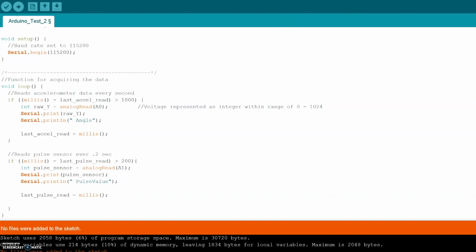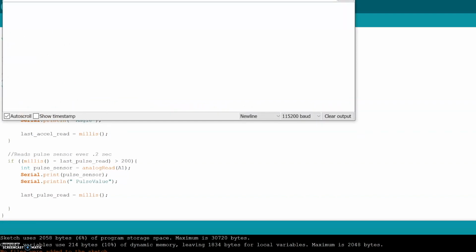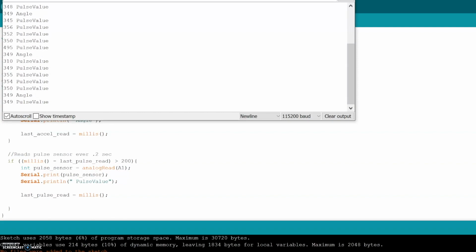When we click on the serial monitor and take a look at it, we can see what is actually being written to the serial port in real time. As you can see, the data comes through as an integer printed on the same line as the string data type as I mentioned prior. Also, it is clear to see that there are 5 pulse sensor samples for every accelerometer sample.